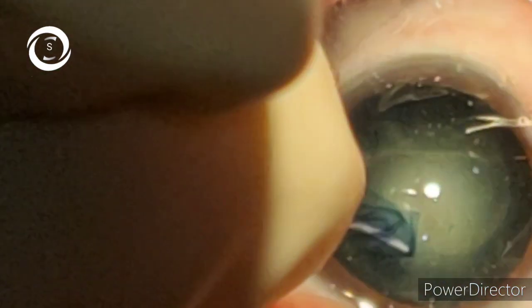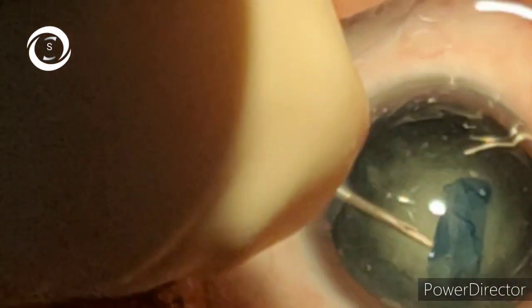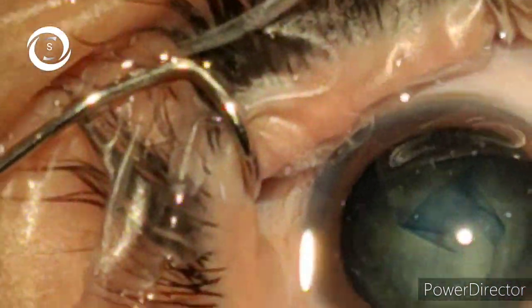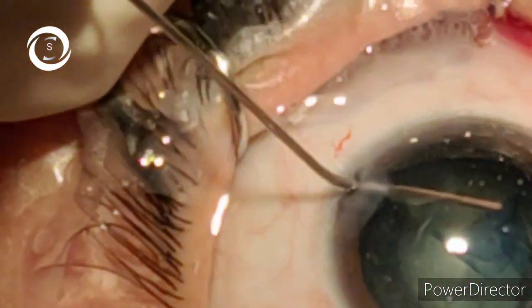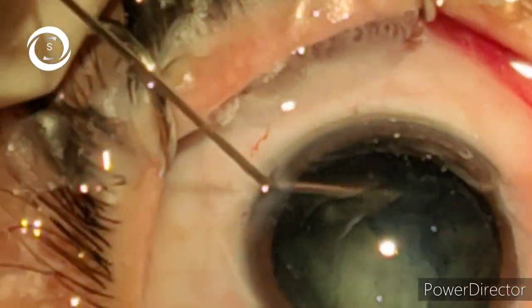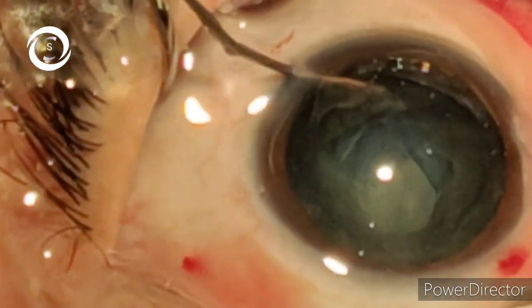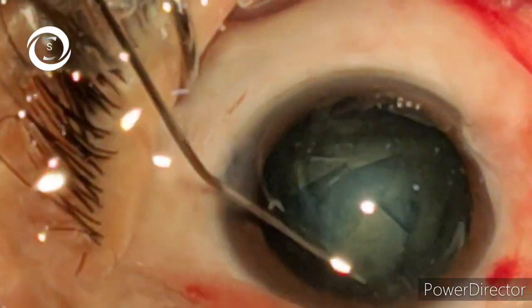It should be of adequate size, 5.5 to 6 mm in diameter. The other most important step is nuclear division. Most of the surgeons learning this art feel difficulty in these two steps. So if you master these two steps, the rest of the ride is very easy and very smooth. In this video, I will show you first dividing the nucleus at normal speed and then in slow motion.